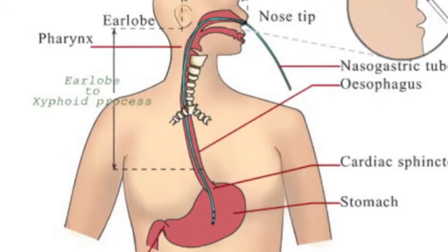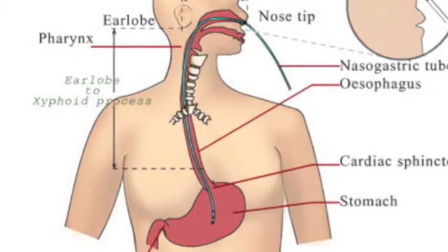Okay. Purpose, decompression. You're taking fluid out, just like you're removing to alleviate pain or fluid production. An example I started to tell you, someone has pancreatitis. Constant production of pancreatic enzymes and other gastric secretions to the point that the person's nauseated, they're vomiting, there's no increased motility, where the buildup of gastric secretions is not going through the GI tract. They need to decompress.